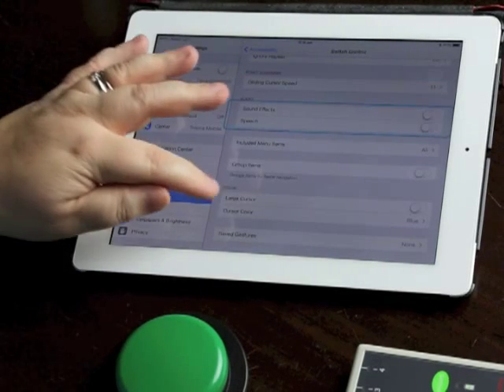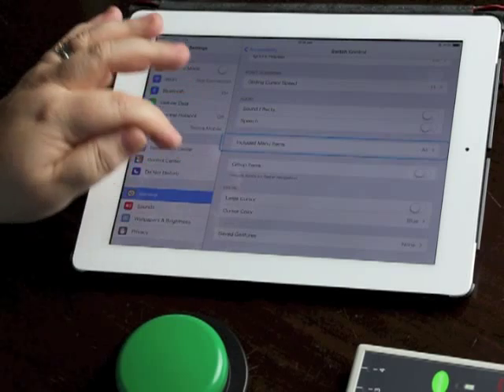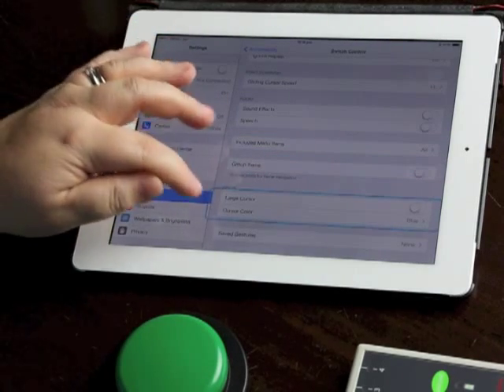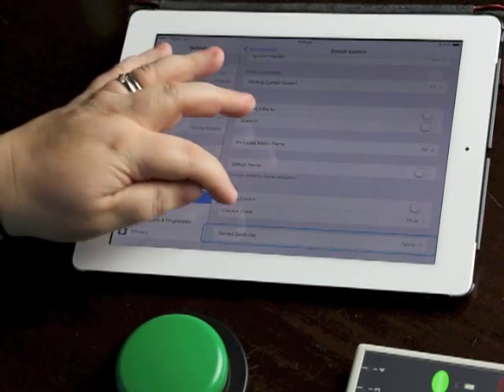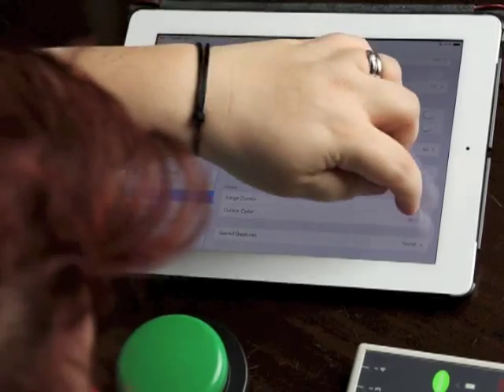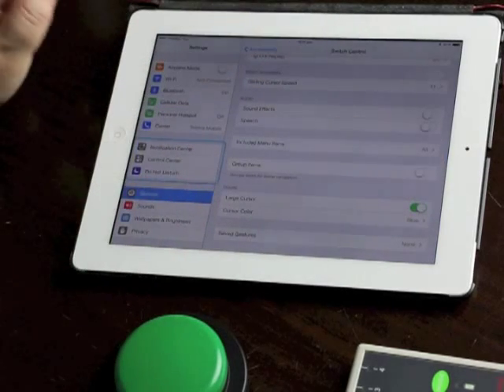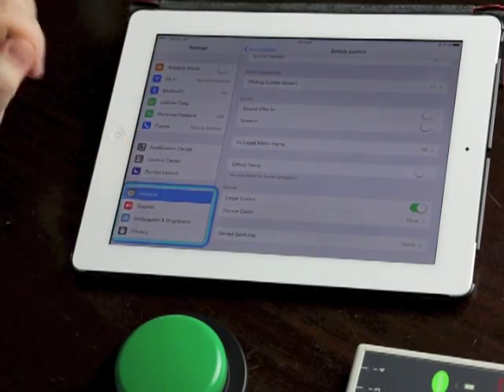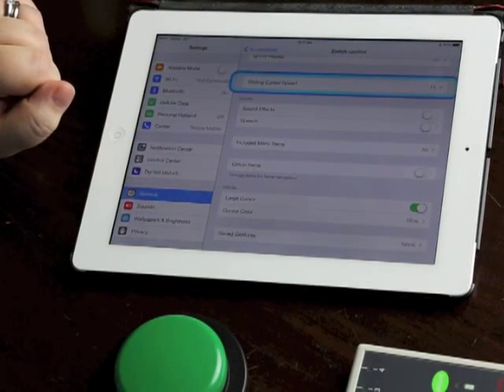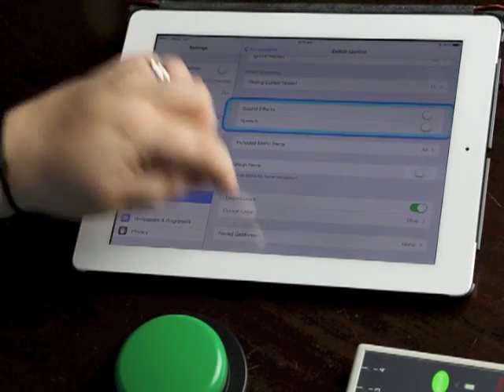Under visual we've got a couple of cursor choices, large cursor and cursor colour. I'm going to turn the large cursor on and you'll see the scanning cursor immediately gets much thicker. I can also go into cursor colour and change it to a different colour whatever the user prefers.